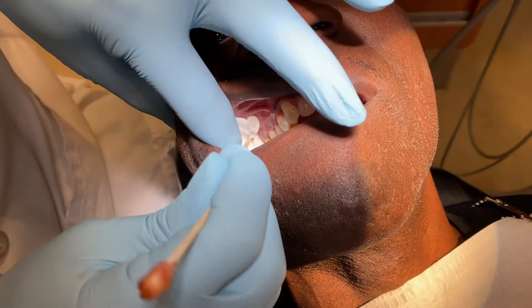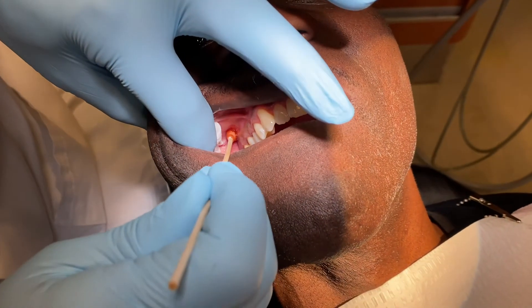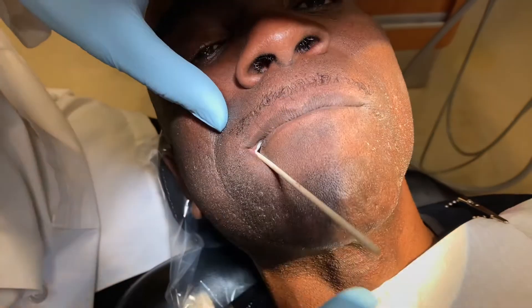I've dried the tissue there with my two-by-two gauze. I'm going to place my topical anesthetic in the area that I'm going for, and get the patient to close down.